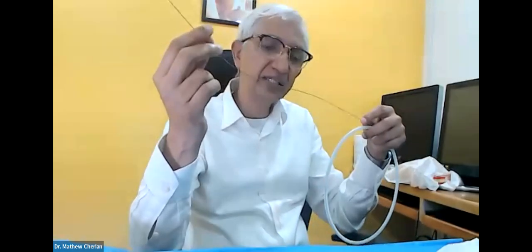And sometimes the commonest place we would use it, for example, we are doing a carotid stenting, we put the diagnostic catheter in the external carotid artery, then we would take this wire into the external carotid artery, pull up the diagnostic catheter and take the shuttle sheath. So we need extra length, and so we use exchange length wires. So in our cath lab, we do not have super stiff wires in regular length. They are always extra exchange length, purely because of this fact that we would use it for many, many exchange maneuvers. Doing a crossover procedure, doing an angioplasty, we would push the extra stiff wire down the catheter, then take a crossover sheath across it.